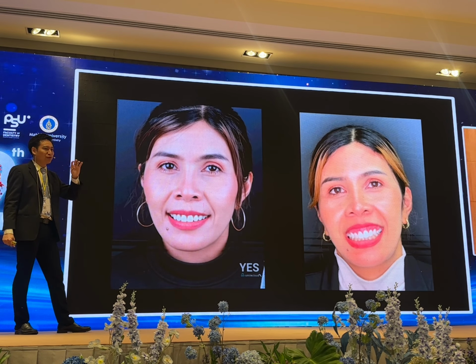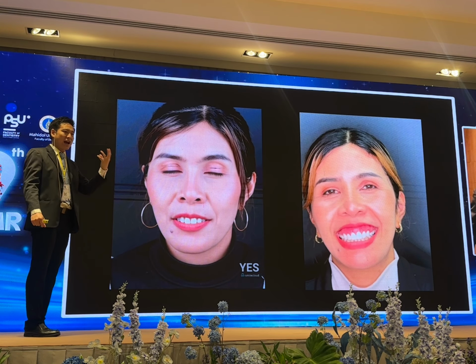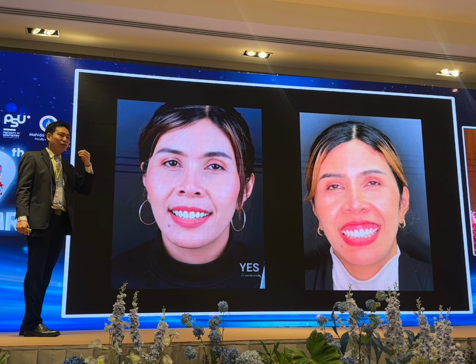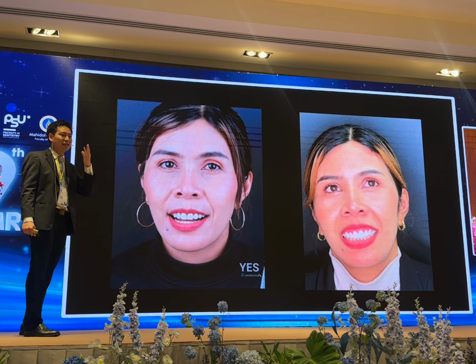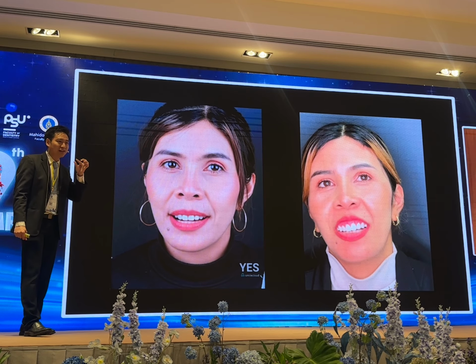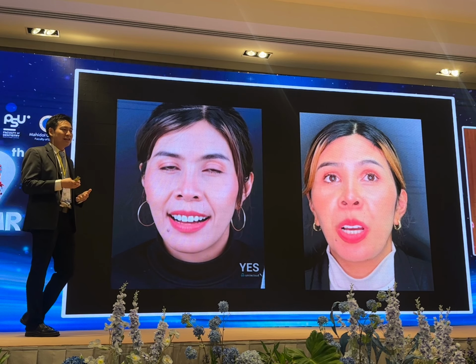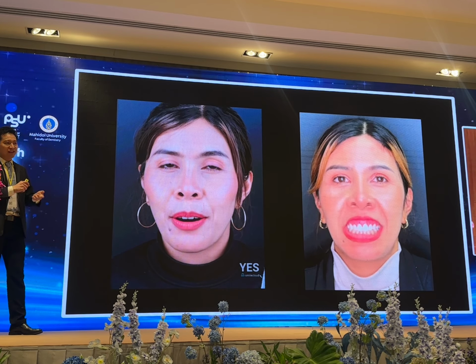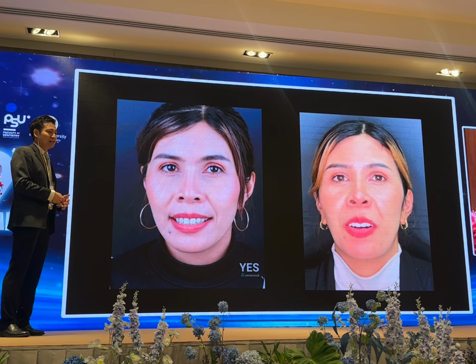In this one, I try to talk with her, I try to make her smile, I try to make her laugh. When she's laughing, most of the time, you expose your gum as much as possible. There's a maximum that's exposed. So that means in the worst case scenario, even if she's laughing unintentionally, it's still not looking too bad. But when she smiles intentionally, everything is good.